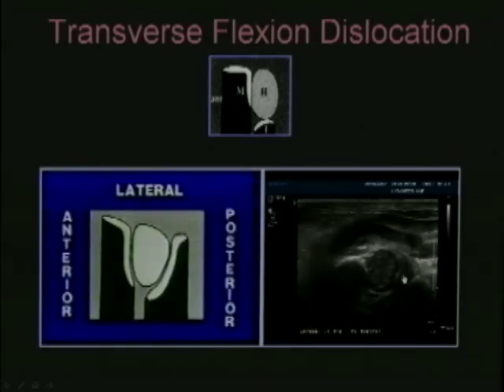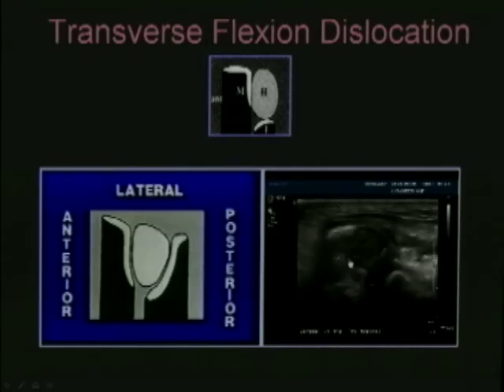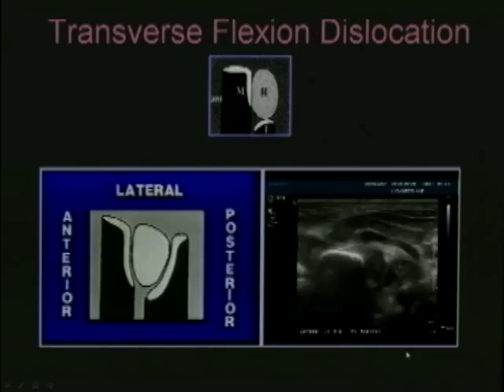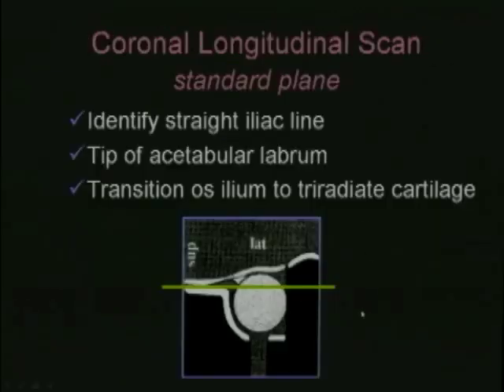This hip is only in a more normal position during abduction and external rotation. It's totally out of what is a very shallow socket, but we can show that this hip is reducible, which is a very important finding when the orthopedic doctors are trying to decide if a patient will benefit from treatment with a Pavlik harness. The other view that we get is the longitudinal coronal scan.